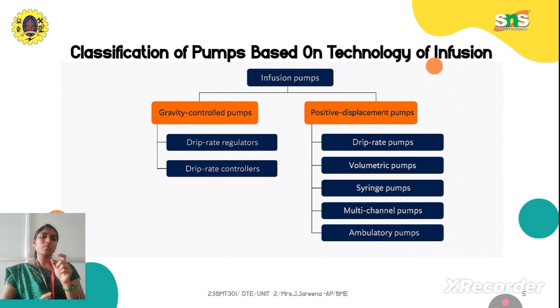So what are gravity control pumps and positive displacement pumps? In gravity control pumps, the flow of liquid or drug, whatever it may be, happens based on gravity. Because of this gravity principle, the drug is delivered automatically to the patient. That is called gravity.